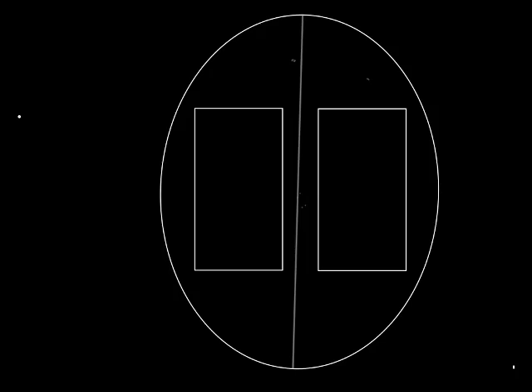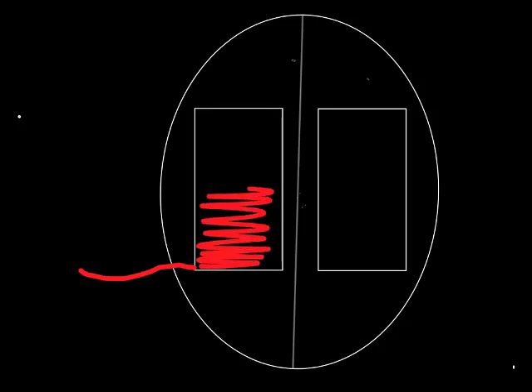I'm going to quickly review some parameters to interpret the CT perfusion studies. So here we have a brain, and these squares represent a given tissue. Here we have blood which is going to come in from a vessel, and it's going to fill up this volume of brain tissue to a certain extent.